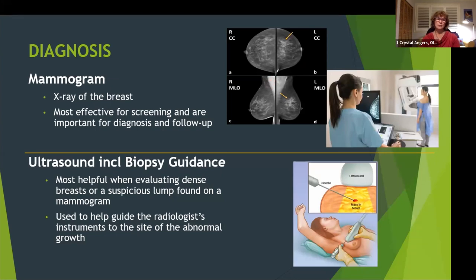In the slides that follow, I will aim to describe to you the various imaging modalities I experienced during my cancer journey. I have sorted them into the 3 legs of my journey: diagnosis, treatment, and ongoing surveillance. The extent of imaging involved in my breast cancer story is really quite remarkable and perhaps surprising. And it begins, as expected, with mammography. A simple X-ray of the breast.